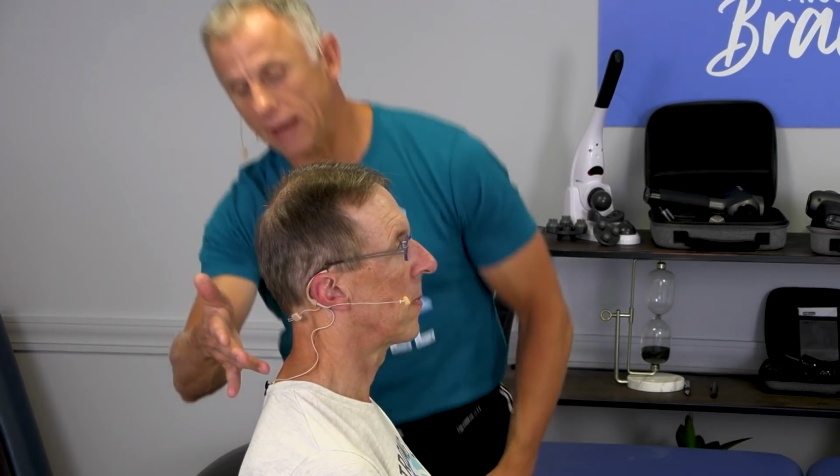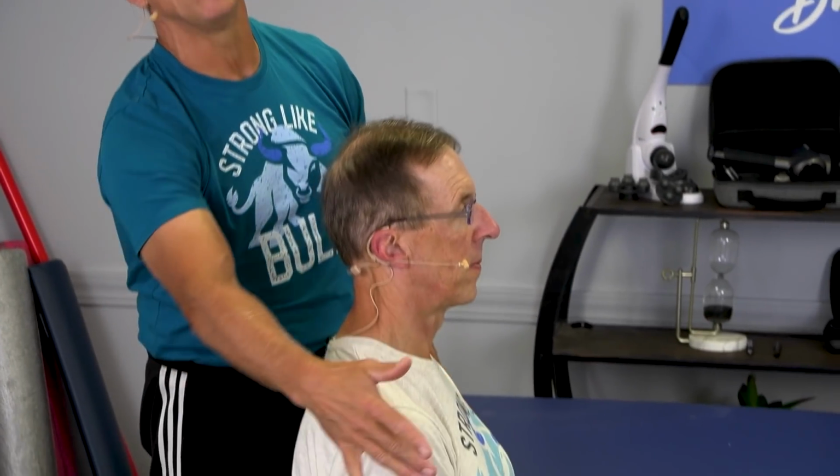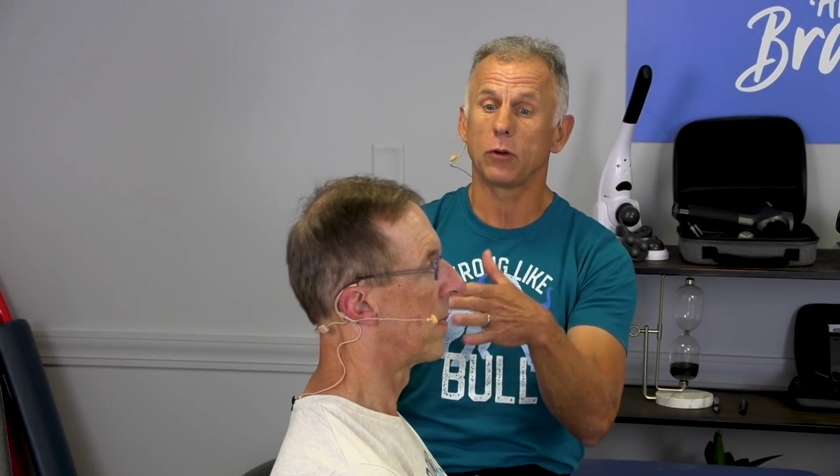Right. If it feels good on the neck, or if you have a pinched nerve, you may have symptoms running into the shoulder blade, down the arm. If the person states, "Oh, my arm feels better," boy, you know it's a good thing. And if you can hold it, I would do it again. And if I had the same response while I'm giving traction as well as afterwards, like after Bob's sitting up and may have him walk around a little bit, if it still feels good, you may be a good candidate for doing this at home for a longer period of time. It's a test to determine whether or not it would benefit you.